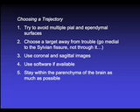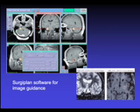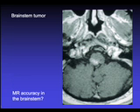The point is to stay within the parenchyma of the brain as much as possible, rather than in the surfaces where blood vessels are located. One software system is the Surgiplan software, which enables the investigator or the surgeon to track the position of the probe as it goes down through the brain.